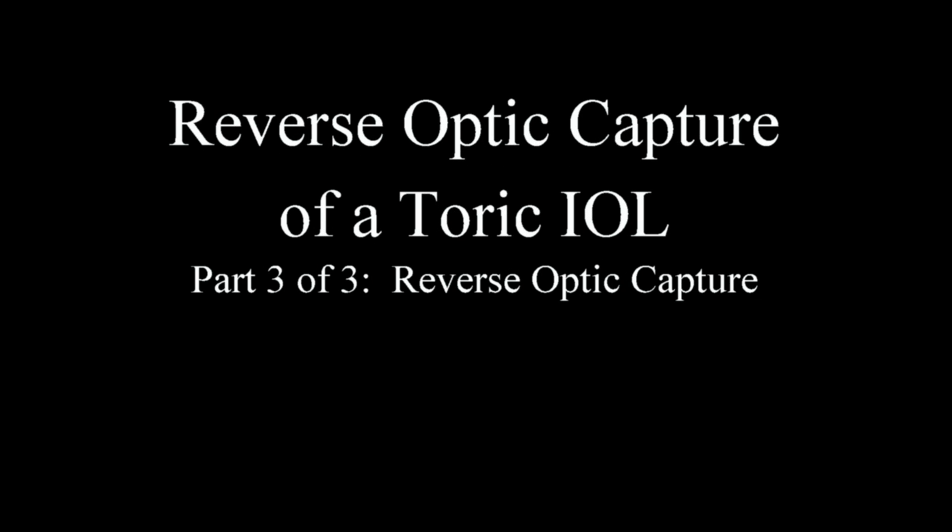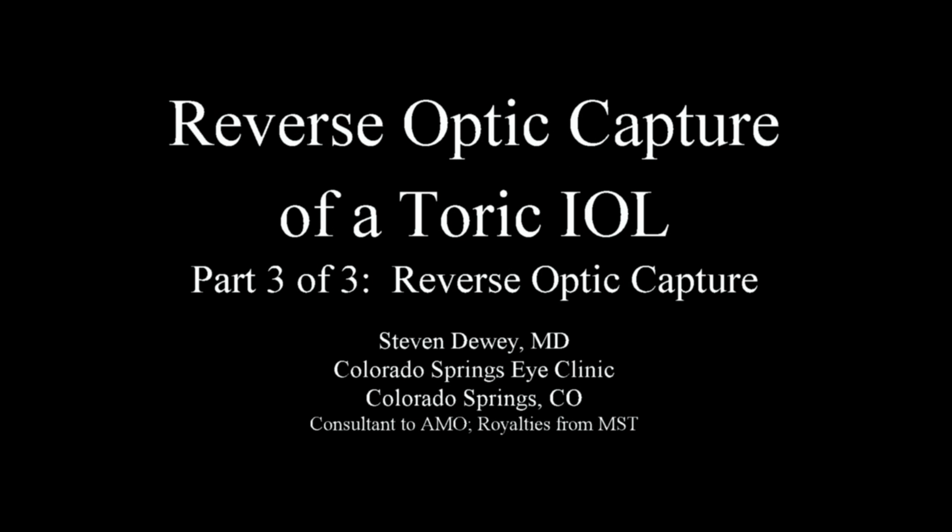Reverse Optic Capture of a Toric IOL, Part 3 of 3. This really demonstrates how the femtosecond laser changed the management of this case. I'm Steve Dewey, still at Colorado Springs Eye Clinic in Colorado Springs, Colorado.